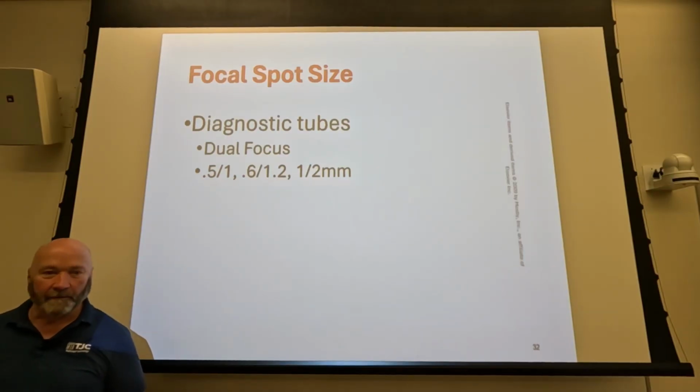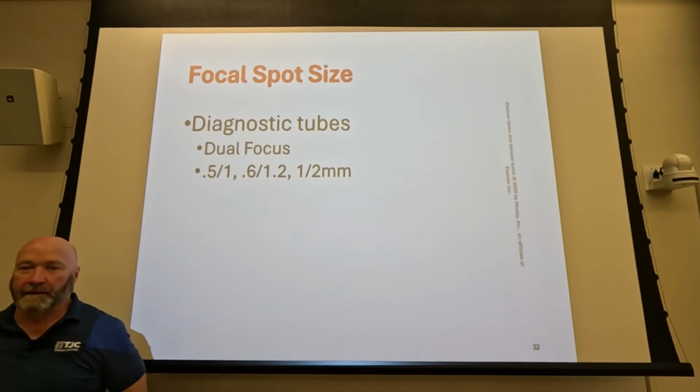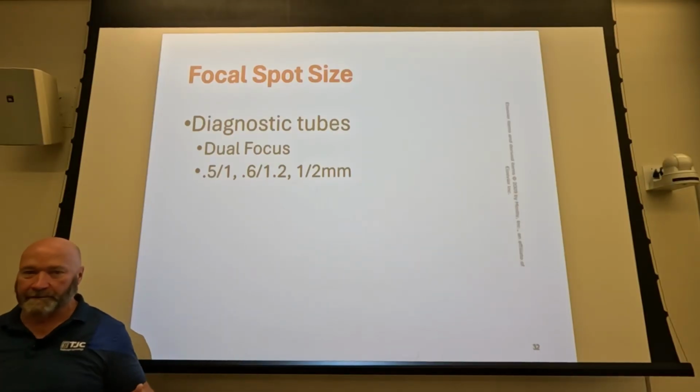Sunny day, where's the light coming from? All from the sun. On an overcast day, where's the light coming from? The entire sky becomes a light emitter. It's not as intense, right, as on a sunny day, but it's coming from everywhere. It's not that you don't have a shadow, it's just your shadow is obliterated because the light's coming in from a whole different types of directions.